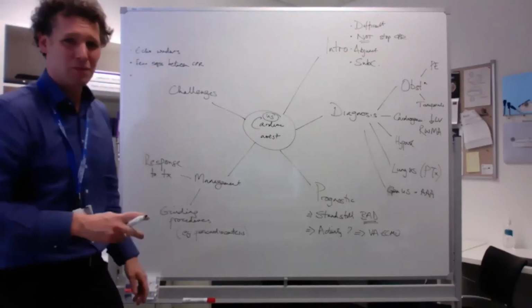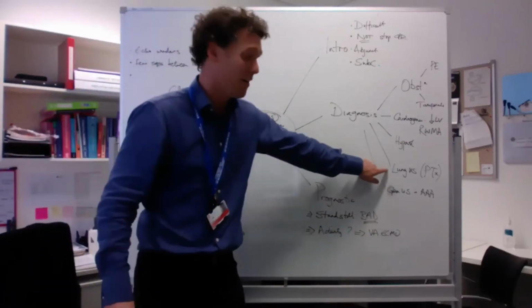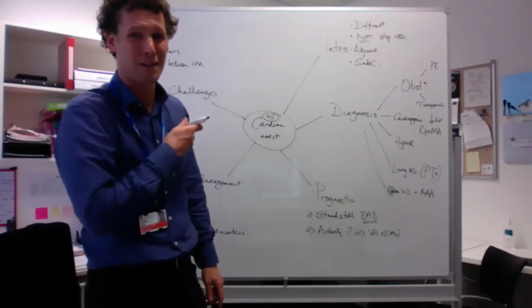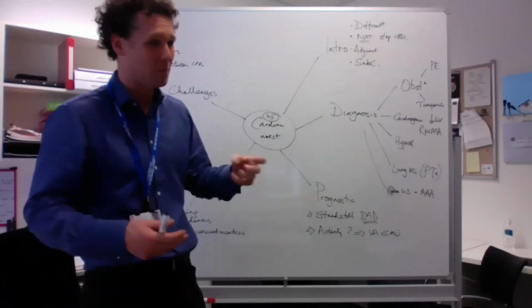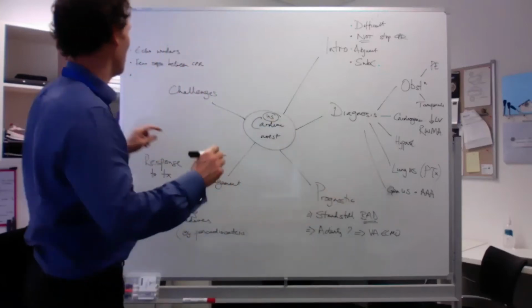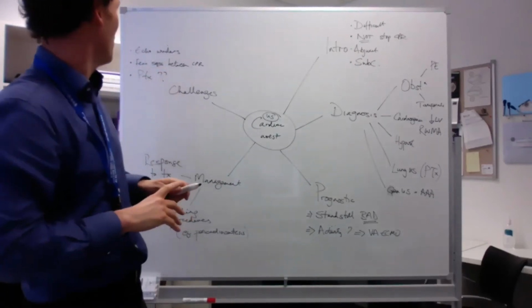Has anyone ever been able to diagnose a pneumothorax causing arrest? Hang on, Raymond, I'm going to have a go. You mentioned this. Have you ever been able to diagnose a pneumothorax during CPR? I've looked for it loads and loads of times, you put the probe on there and someone's bag masking, and I think it's really hard. So I'm going to say pneumothorax is a hard diagnosis to make during CPR.